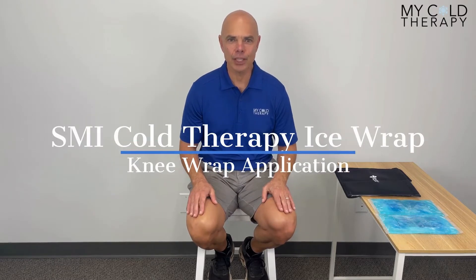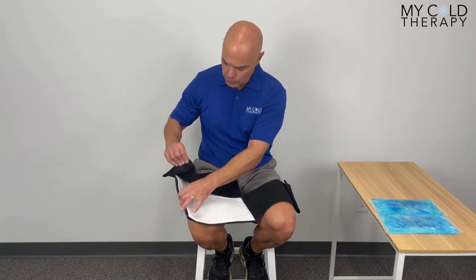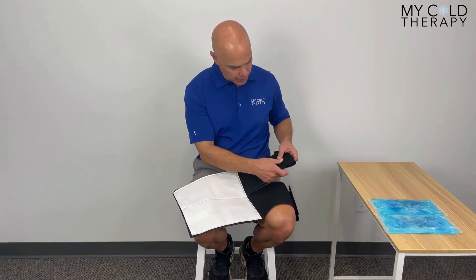Hi, this is Steve from My Cold Therapy and today we're going to do the application video for the SMI knee cold therapy wrap. This is what it's going to look like when you get it in the mail. First thing I always do is take the velcro compression straps and put the tab down so that it doesn't get stuck on itself.